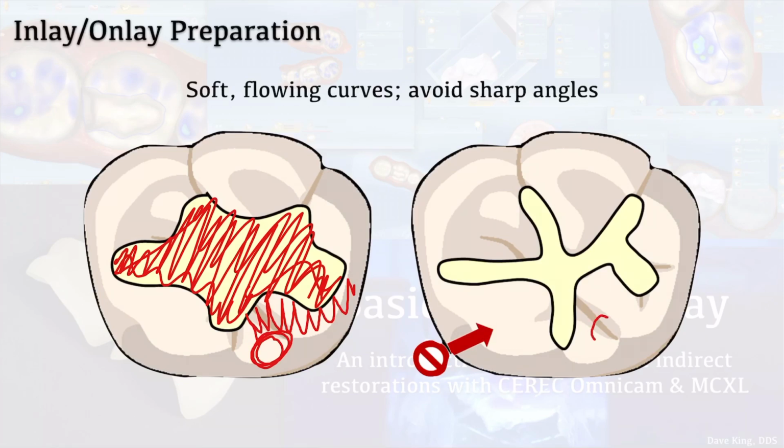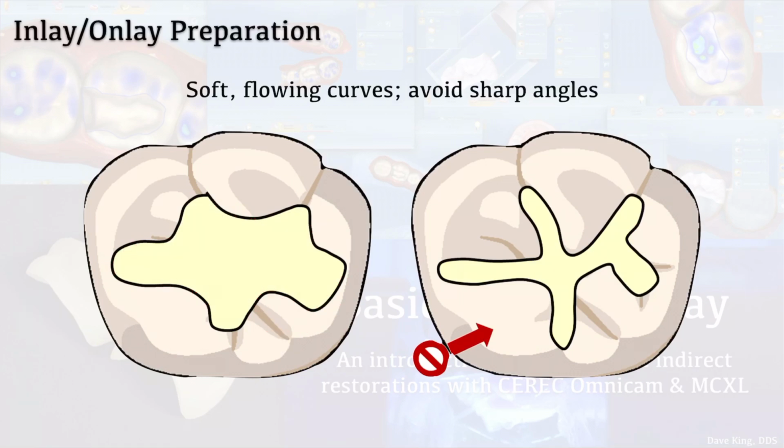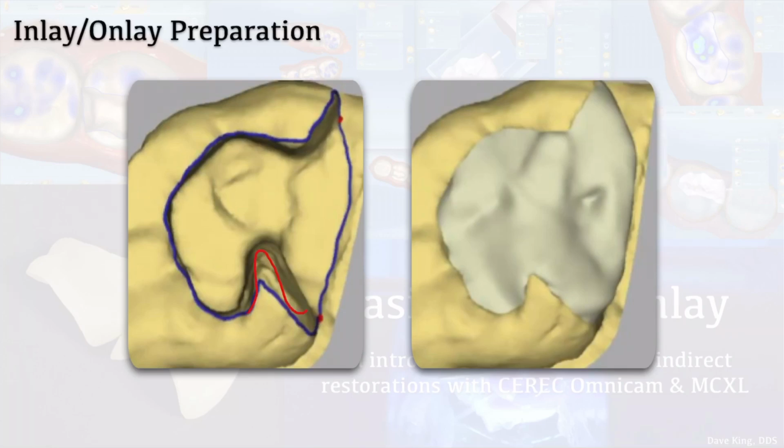Can you imagine having a circular burr that's going to try to get into that little edge, or this area? Not going to happen. Or that area effectively, or that one. That's why everything needs to be rounded. So we need to round everything appropriately and make sure there's enough extension for the burrs to mill it correctly. Otherwise, when you try to seat it, you're going to get a nice fracture. Here's kind of a problem there. Can you see that the round burr is not going to be able to get into that spot? It's just impossible.